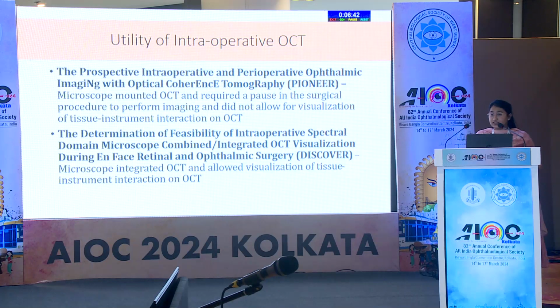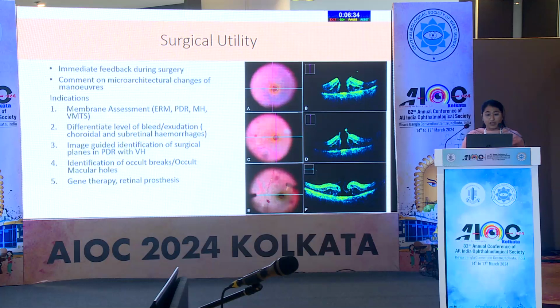Whereas the Discover study used a microscope integrated OCT, so it provided us with a tissue instrument interaction that was visible during the surgery. For the surgical utility of OCT, it's providing us with an immediate feedback during our surgery, and it can also comment on the micro-architectural changes of our various heroic maneuvers that we carry out during our surgery.